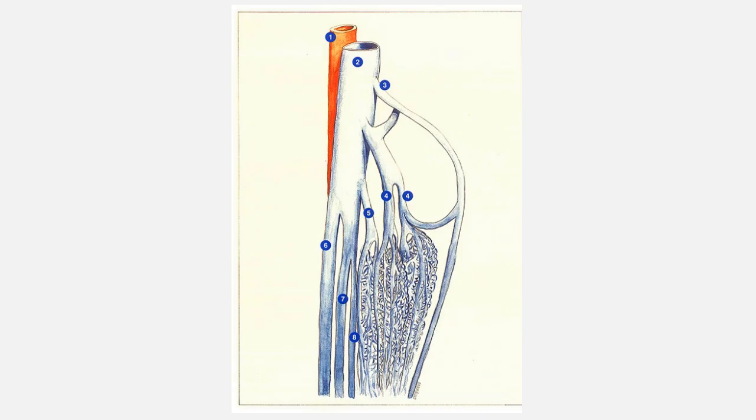So sometimes we can see multiple medial gastrocs. Sometimes we can see multiple lateral gastrocs. But in reality, what you want to do is get one medial, one lateral. I'm sorry, I did that backwards. One medial, one lateral. Now look at if you go a little bit further, right? So say you're scanning slightly lower in the calf, you might pick up three medial, three lateral, right? And then all of these are going to be too small that we're not going to see and pick up anyway. But it all depends at the level in which you are scanning.